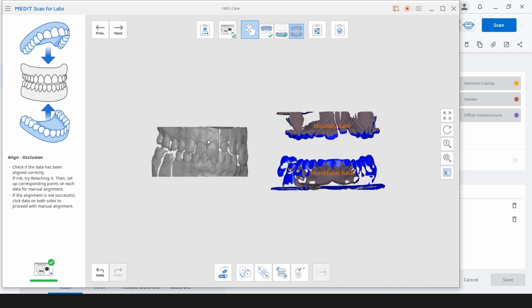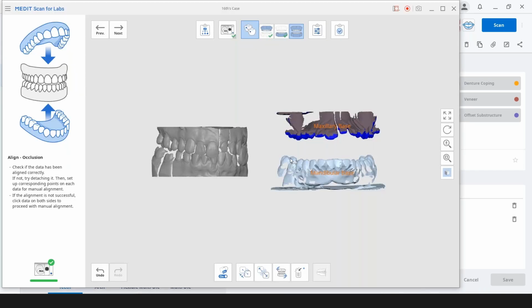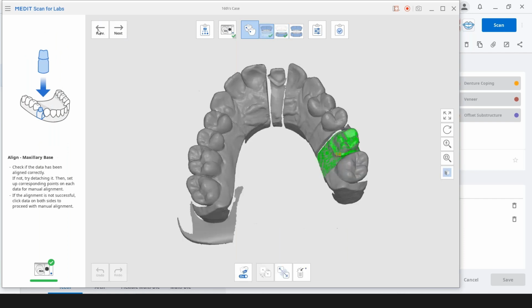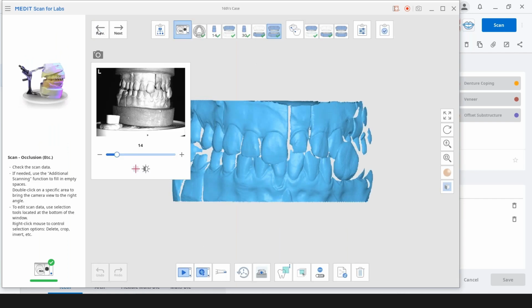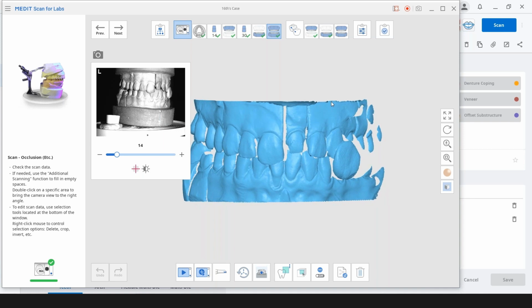And like I said, if you go to the next step, or it probably won't let me go to the next step actually. Let me see if I can go back. Yeah, so that trimmed out nicely. I'm not sure what I did there. Well, that's dental lab technology, I guess.